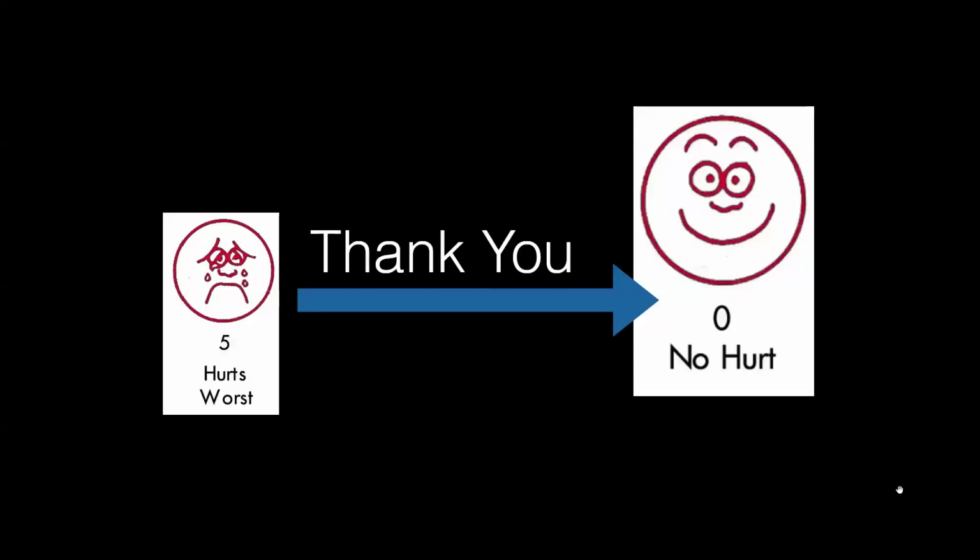All right, so that was fascia iliaca. We did the PENG, the IPACK, the popliteal, the Raj and the Labat, the adductor, the femoral. That's the lower extremity. I mean, the other thing is ankle blocks, which would be great.